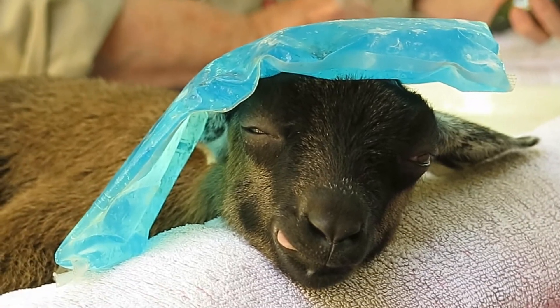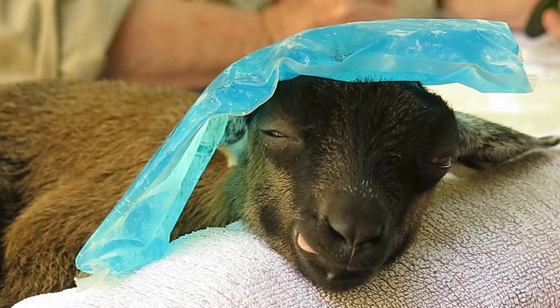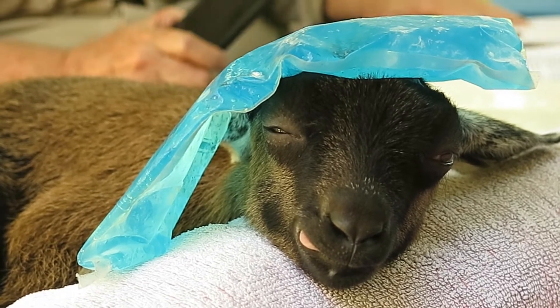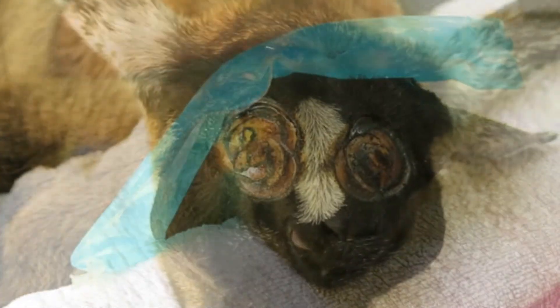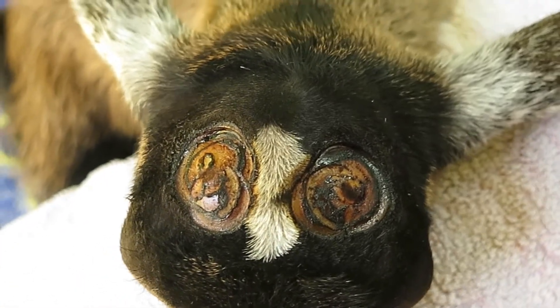The kid is recovering, but you can see it's still anaesthetised. This is a close-up of the figure of eight burn.